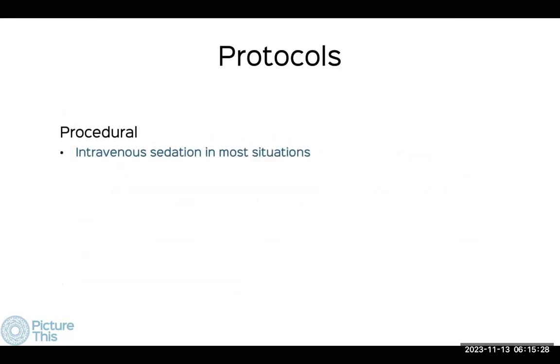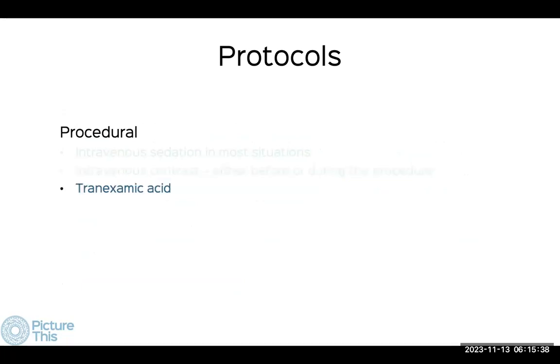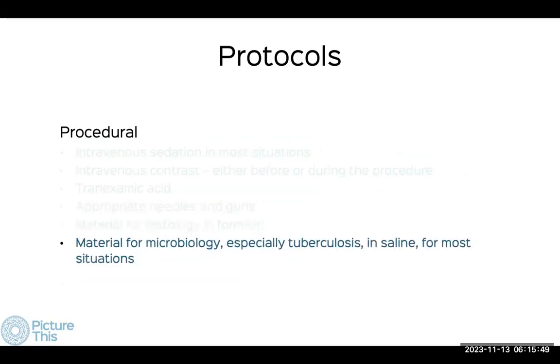During the procedure, we use intravenous sedation in most situations. Intravenous contrast with bone and soft tissue tumors is not usually used. I mean, this is more for liver, pancreas, etc. If the patient bleeds, we give tranexamic acid. And then obviously you have to use the appropriate needles and guns, take material and formalin for histopathology.